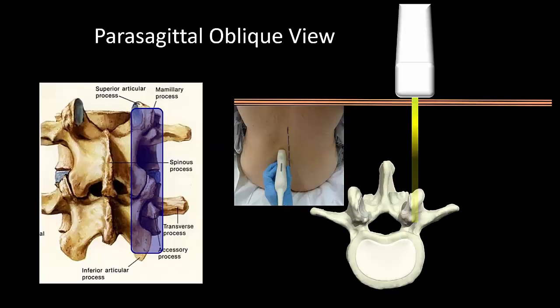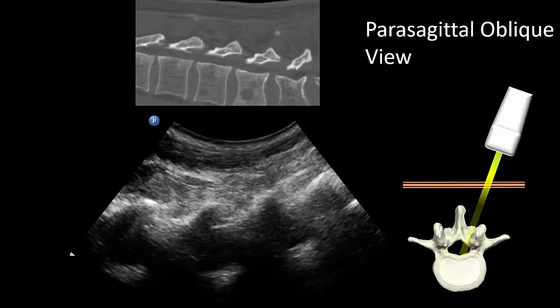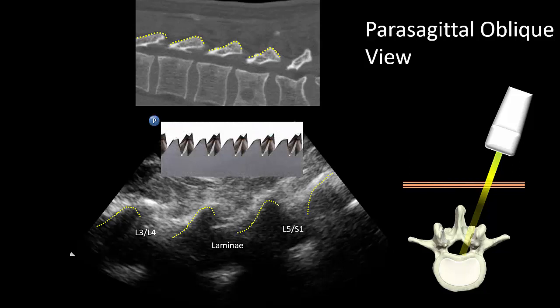As with all patients, we start with a parasagittal oblique view. The probe is placed in a longitudinal orientation and angled towards the midline to direct the beam through the interlaminar windows. What you expect to see are these characteristic sawtooth-like shadows which are the laminae of the lumbar vertebrae. Adjust the probe with small sliding and tilting motions to visualize the anterior complex, which is located about two centimeters deep to the base of the sawtooth or lamina in most adult patients.